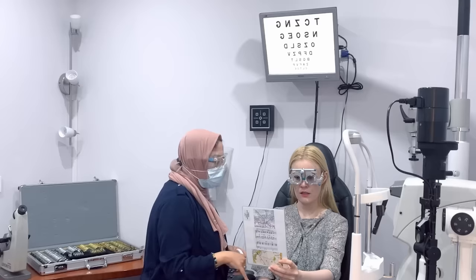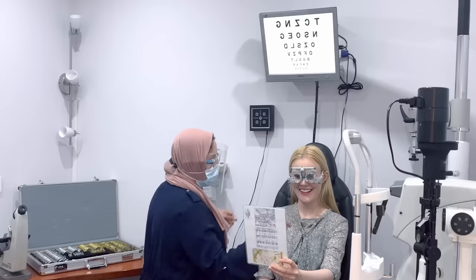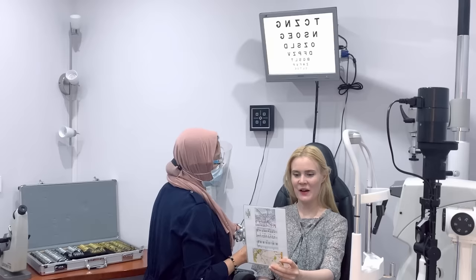Anything below that you can see? I think I can see all of it. All of it. Keep that position, okay. And I'm going to take this off. And do you see a difference at all? Yeah. Which one do you think looks better? Oh, it's much better with the glasses. Yes, on. So now you know what's going on.